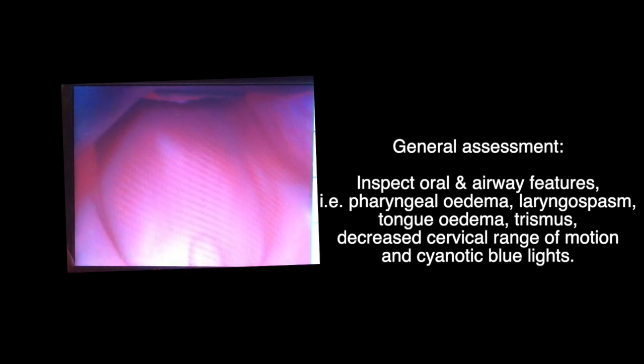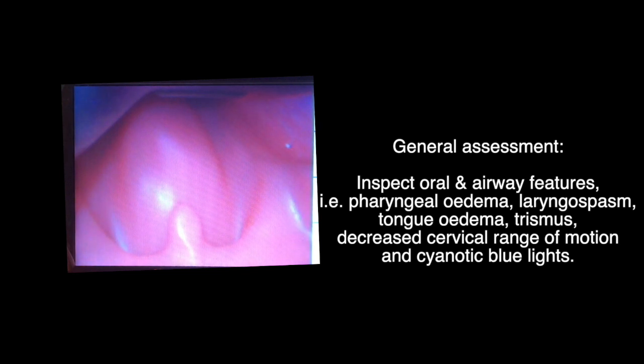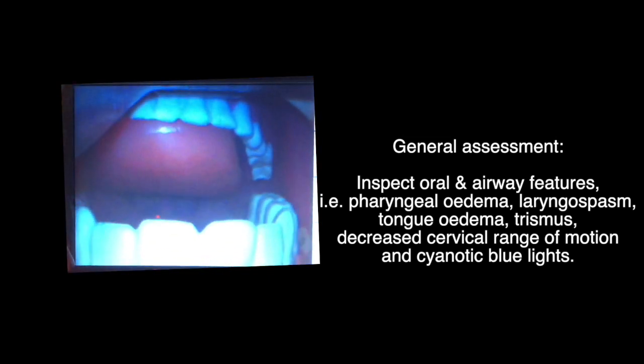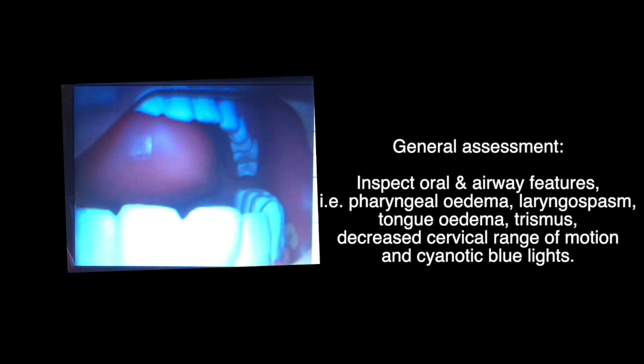After this structure check, we can reach out to the manikin control laptop to trigger various airway functions as the laryngoscope retrieves outwardly. With this, inspect pharyngeal edemas, laryngeal spasm, and tongue edemas individually. This movement may stress the oral cavity and create opportunity to detect abnormal wall findings.